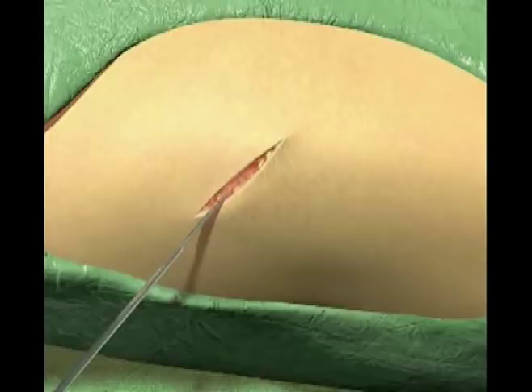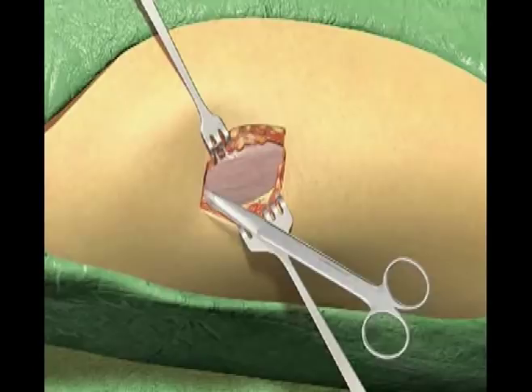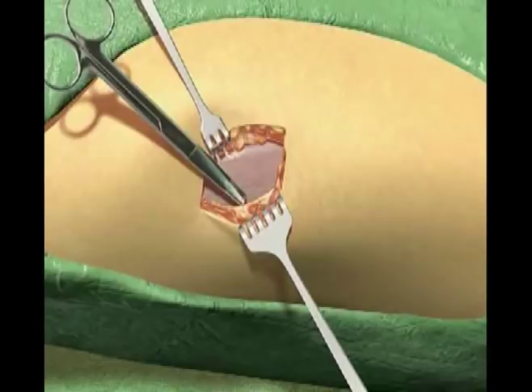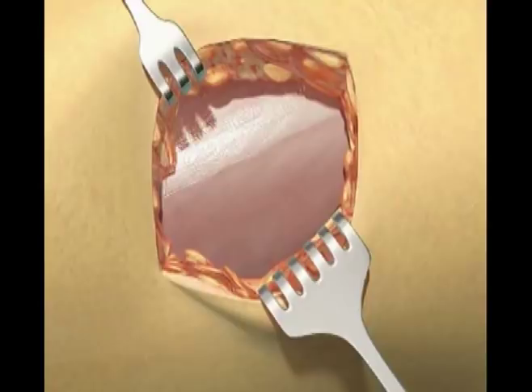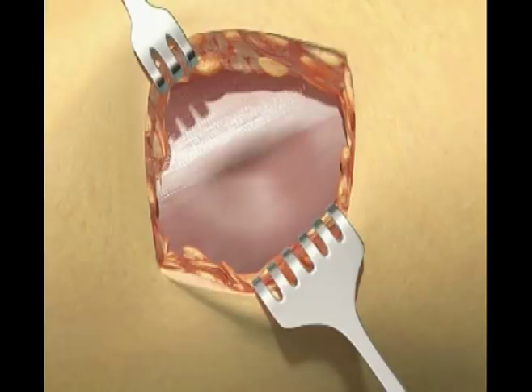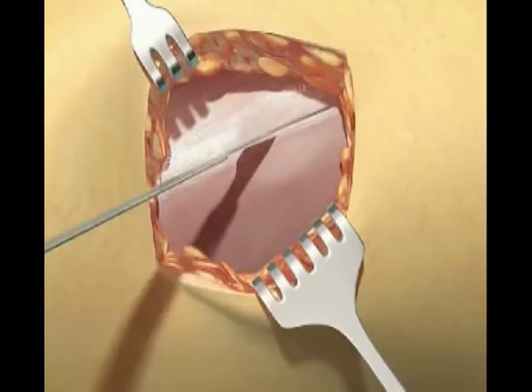Make an initial skin incision and then divide the fatty layer in line with the incision. Lift the skin and undermine the fatty layer to create a mobile window sufficient to expose the capsule, but not so extensive as to risk necrosis of subcutaneous tissue. Incise the fascia approximately 2 to 5 millimetres medial to the underlying border of fascia latae, following the direction of the skin incision.